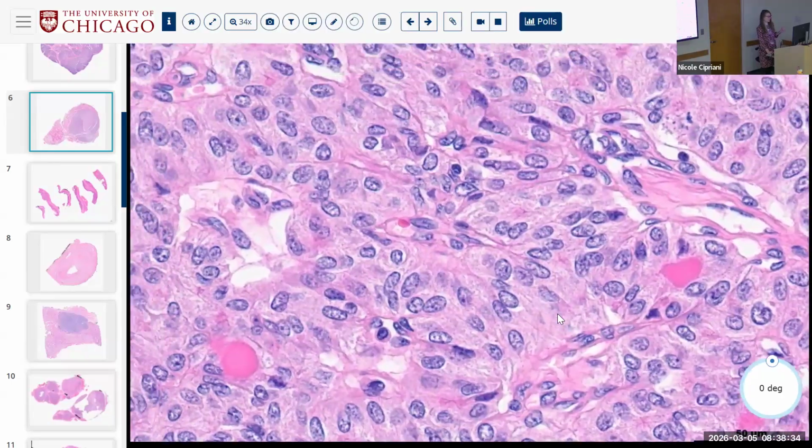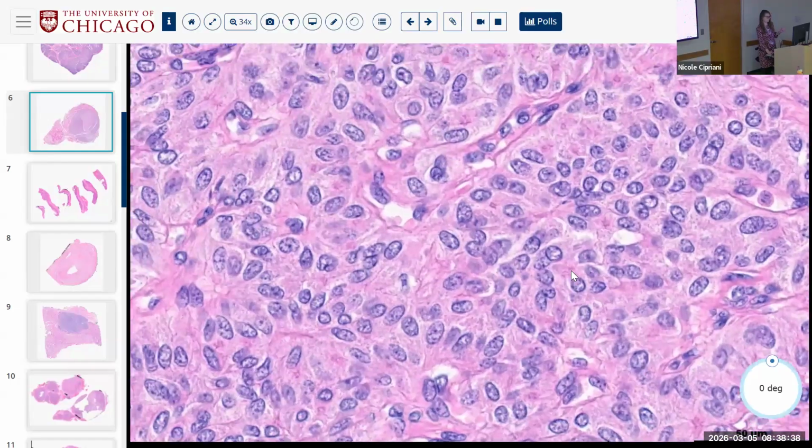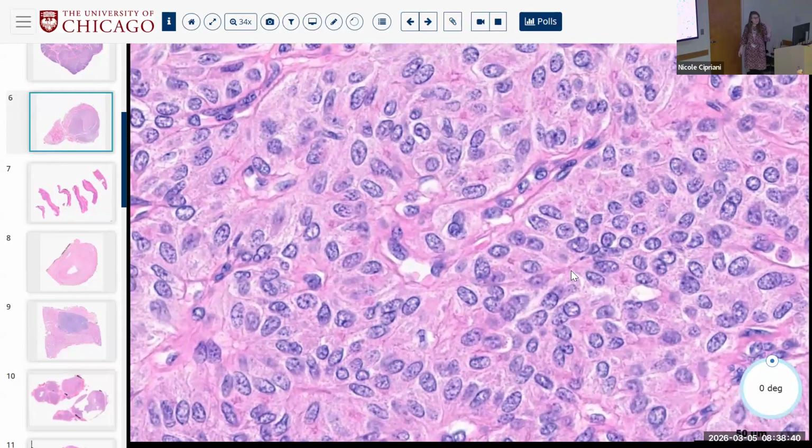And now we're talking about the nuclei. It's more like grooves and... Yes, so hyalinizing trabecular tumor has, in any other circumstance, nuclei that are like 5,000% papillary. They have beautiful pseudo-inclusions, tons of grooves and wrinkles, thick, dense cytoplasm, right? They just happen to be arranged in trabeculae and happen to not be invasive and happen to really not ever metastasize, right? Otherwise, the nuclei are PTC, okay?